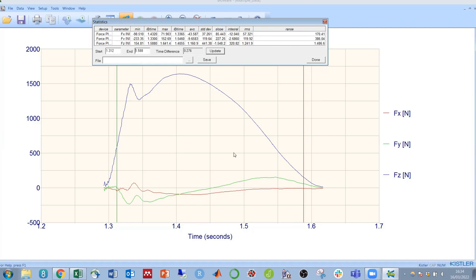We also get average and standard deviation forces. The slope is the rate of change of force between this start and end time, and the integral is the impulse in that direction between that start and end point. We also have the time difference, so the duration between these two lines.